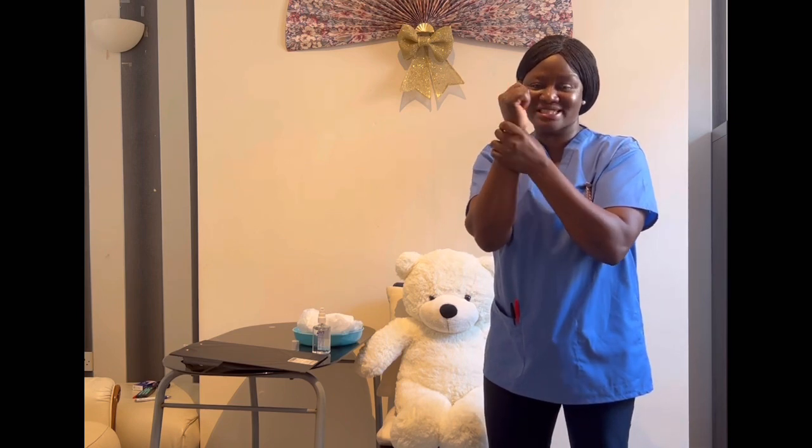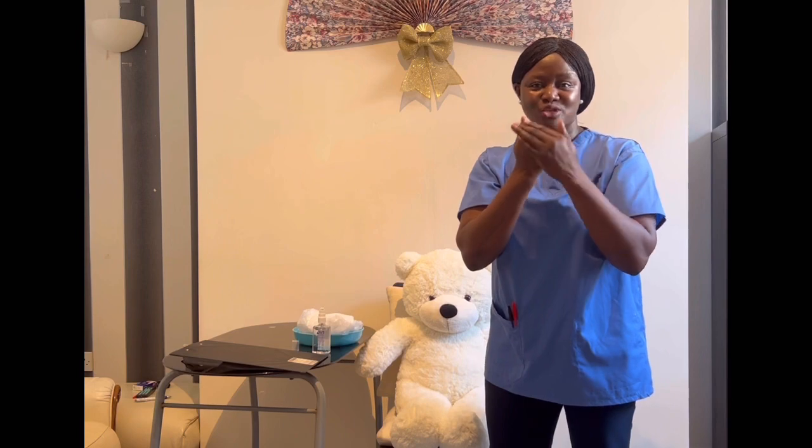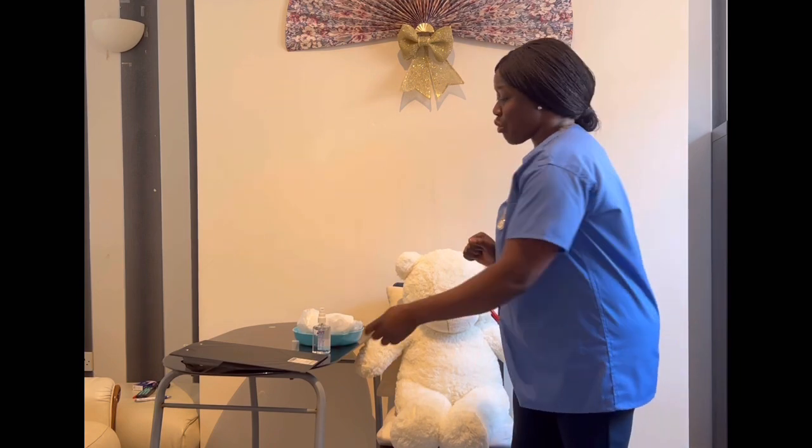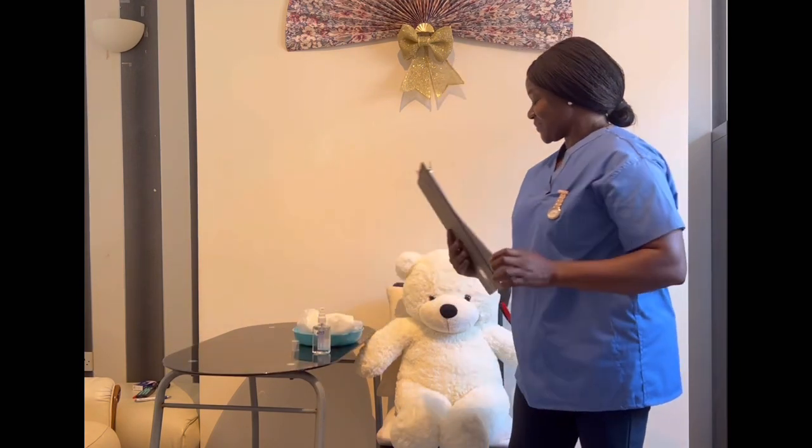I put my hands apart and allow them to dry for 30 seconds as I approach my patient.